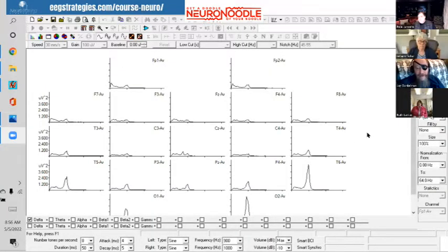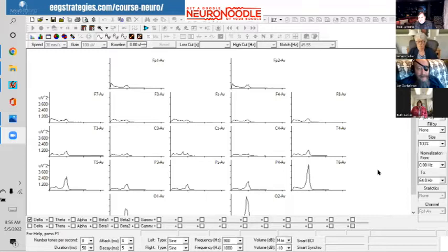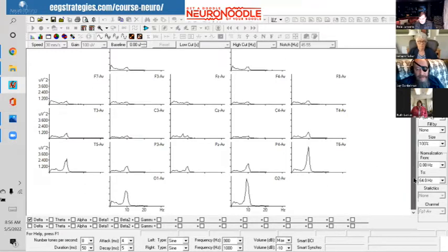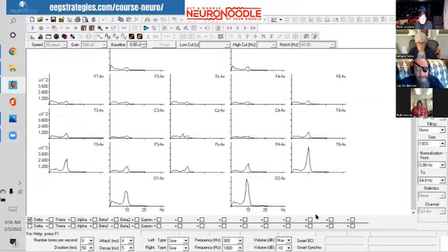When I look at the eyes closed EEG on somebody that has PTSD, the biomarker that stands out, not in the eyes open where lambda happens, but with the eyes closed, is the right temporal parietal junction.